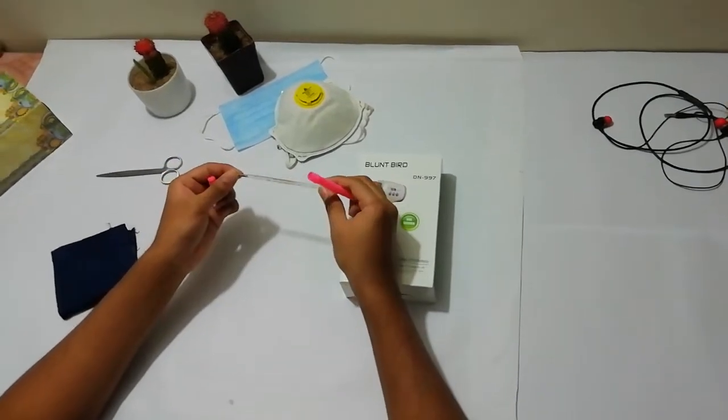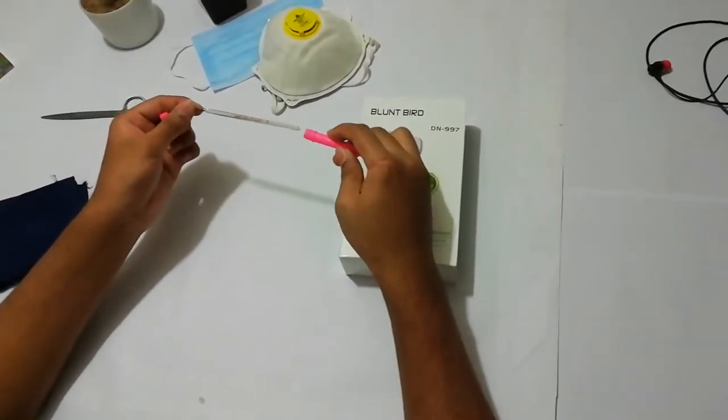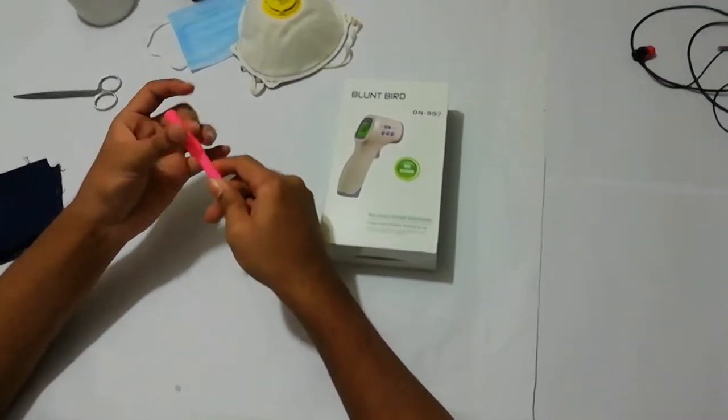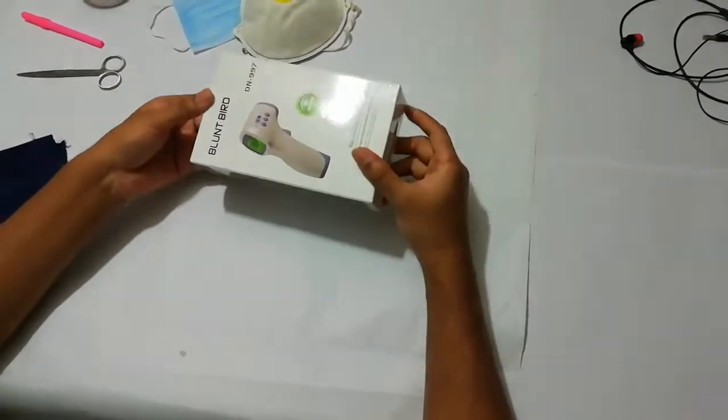And it comes with Fahrenheit scale. You see here. And it's an ordinary thermometer. Let's keep it inside and see what is in this box.